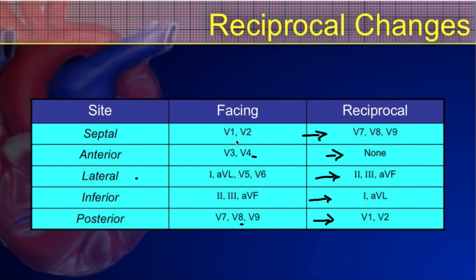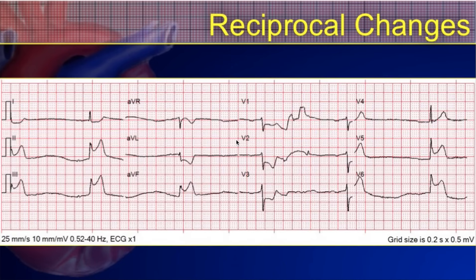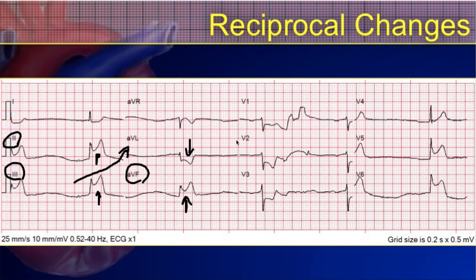Here's an example of an inferior wall infarct. We have ST segment elevation in leads 2, 3, and AVF — the inferior leads. When I see ST elevation in inferior leads, I immediately look at AVL for reciprocal changes, because leads 3 and AVL are the most reciprocal pair on a 12-lead EKG. Sure enough, there is ST segment depression in AVL. That alone is enough to call this a STEMI — no mimic or pattern outside of an electrolyte derangement would replicate this, and patient presentation helps confirm it.